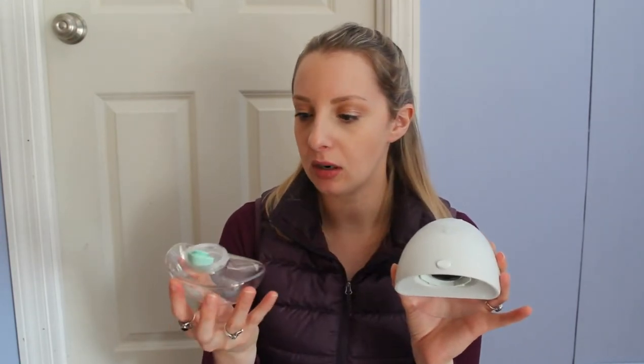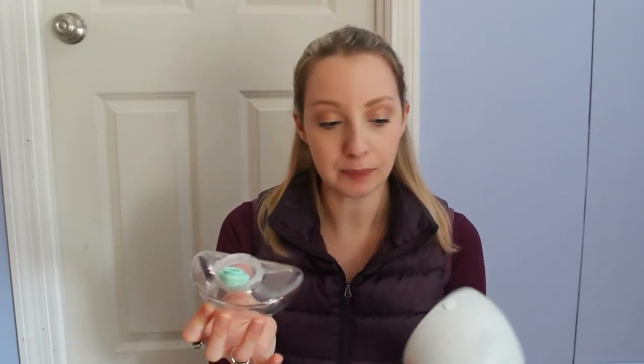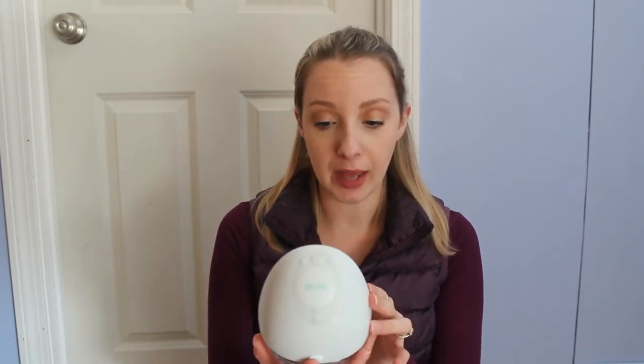This little button is what releases this part off. And it looks like these can hold approximately five ounces, which is awesome. This is a closed system pump — love that.